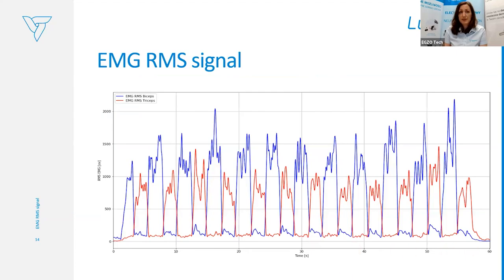This is the rectified signal — very clear. You can see two channels: EMG activity from the biceps and triceps in this case. It's way less messy than the raw signal, so it's easier to read and evaluate the muscle activity of a certain patient.